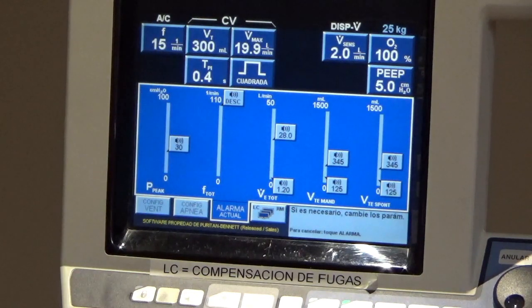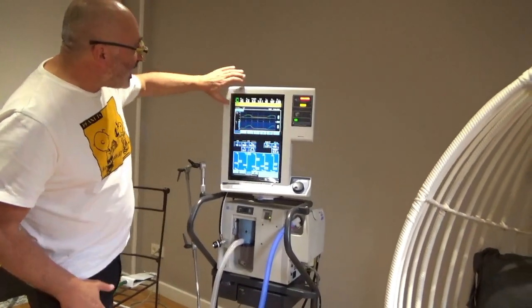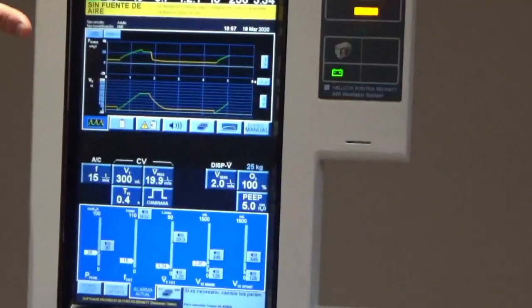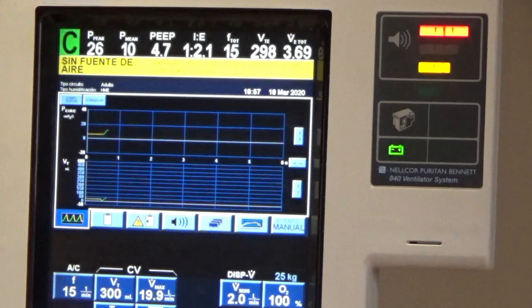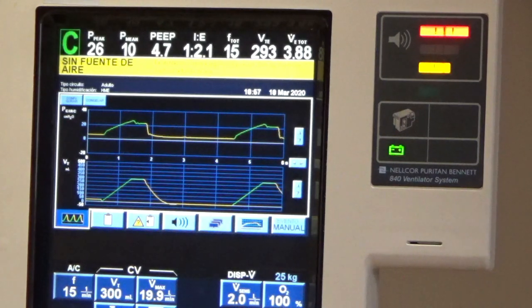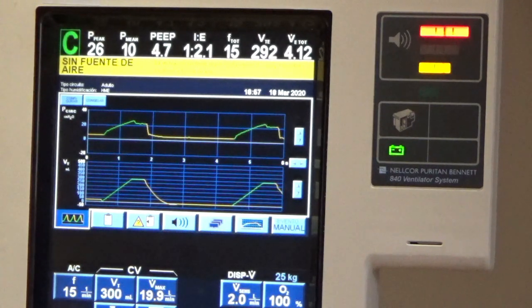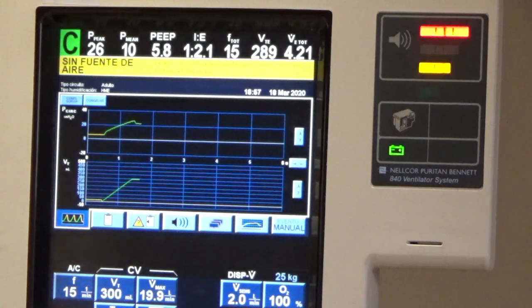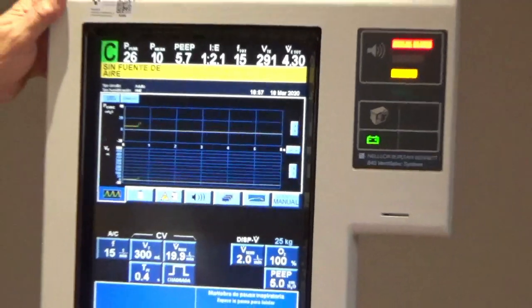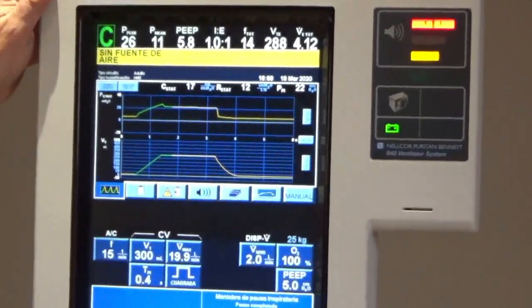Let's connect the patient. We have here our simulator. First of all, we have to check the numbers on the top of the screen. The most important is the peak pressure, because in volume control mode the tidal volume is constant, but the peak pressure varies depending on compliance and resistance. We should not only focus on peak pressure but also on plateau pressure, which we can calculate using the inspiratory pause maneuver. Here we have a plateau pressure of 22 cm of water.